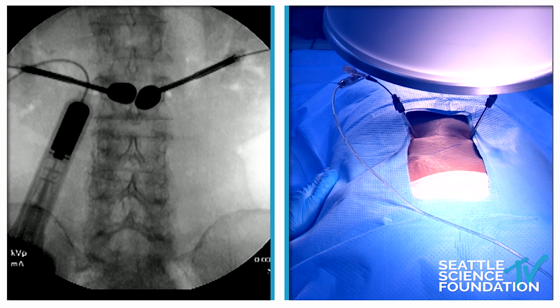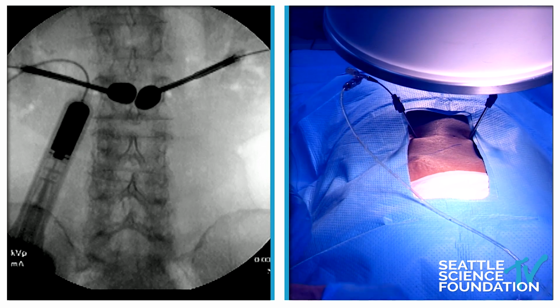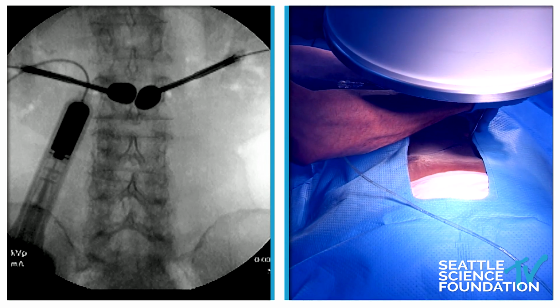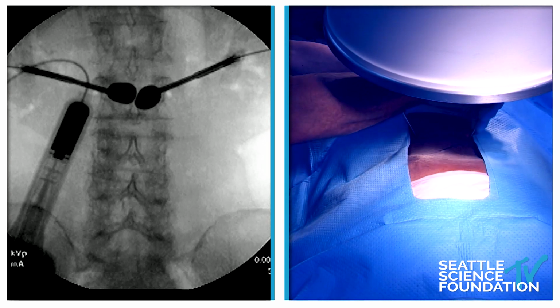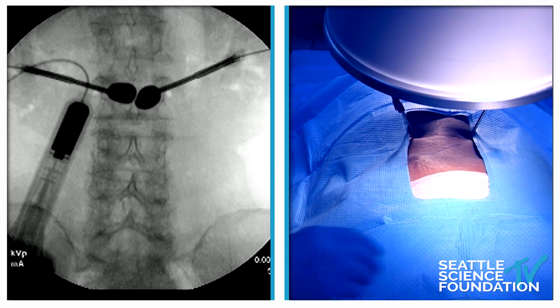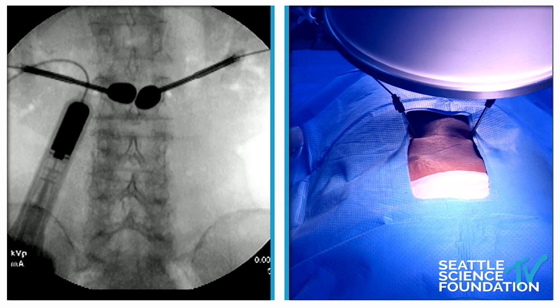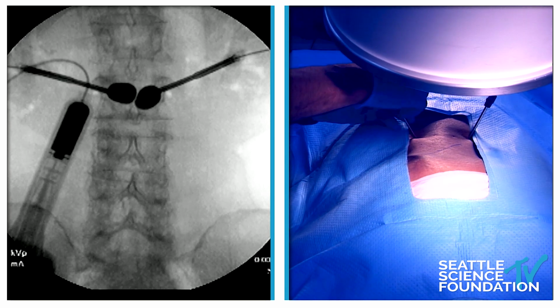And so the maximum stability and strength of a reconstructed vertebral body is this exact picture, where the balloon and the subsequent cement goes to or slightly beyond the medial border of the pedicle on both sides. So the central vertebral body is now maximally stabilized. And this vertebral body is ideally reconstructed the way Doug has it, with these balloons kissing in the center and the outer circumference of the balloon underneath the AP view of the medial border of the pedicle. So this is perfect placement for cement augmentation.